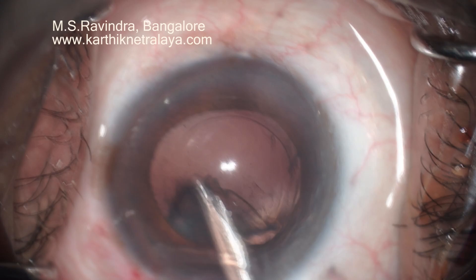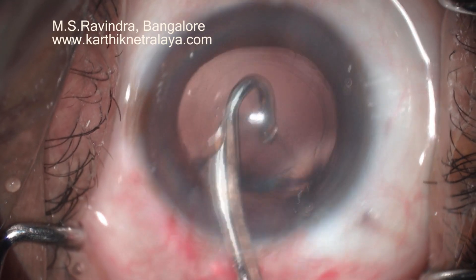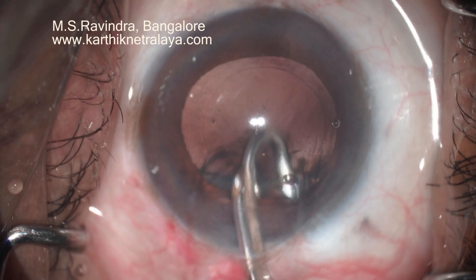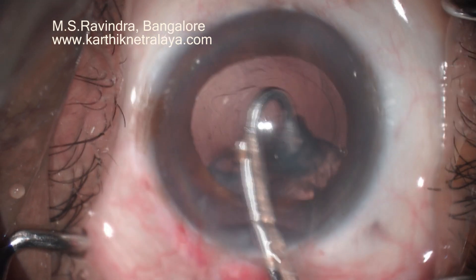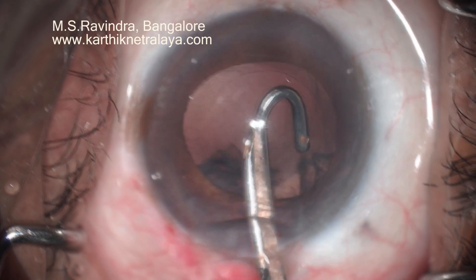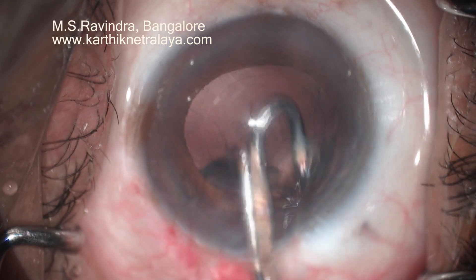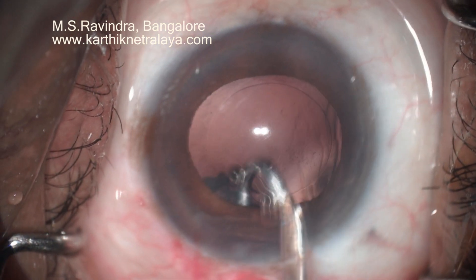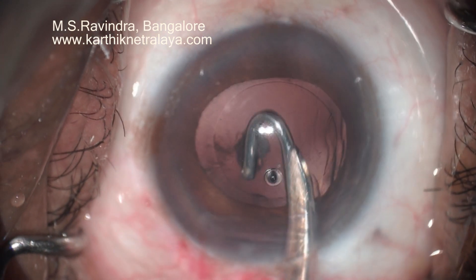A Simcoe cannula is used to irrigate and aspirate the pieces and aspirate the cortex out of the capsular bag. Because of the capsular separating hydrodissection, the process of cortical aspiration is pretty easy and doesn't take much time. Sub-incisional cortex is aspirated using J-shaped Simcoe cannulas.